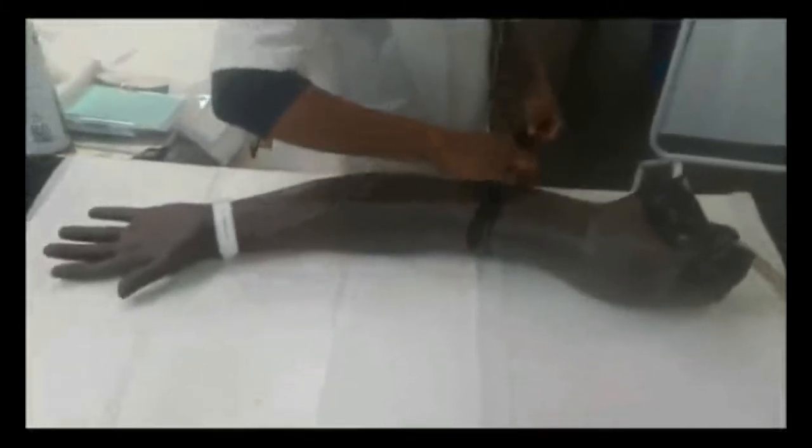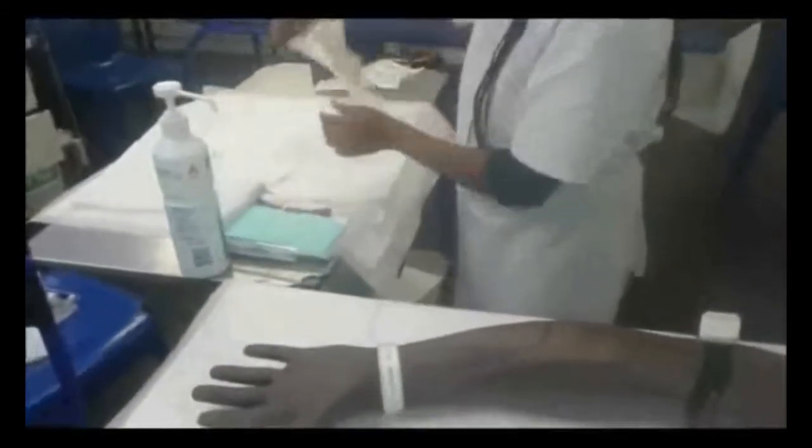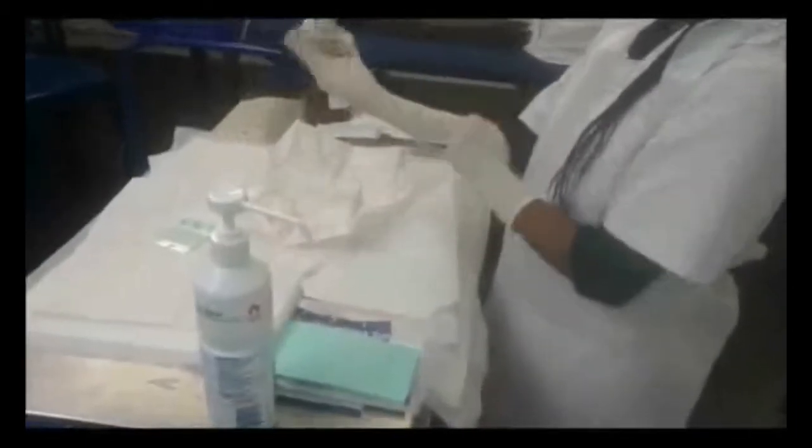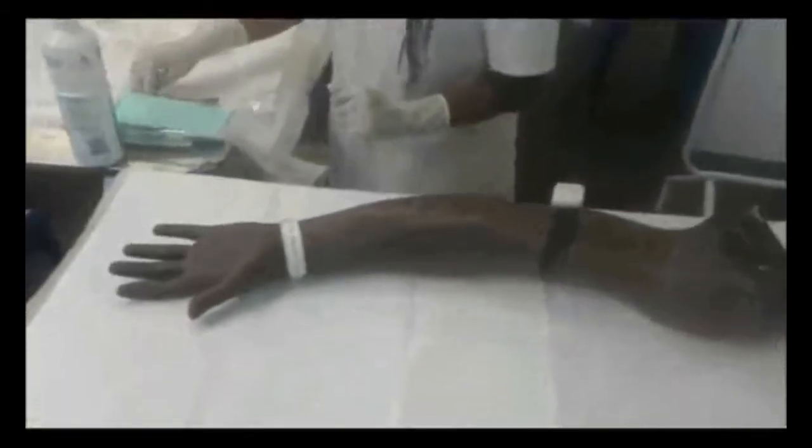Next step will be to put on your tourniquet above the antecubital fossa. This tourniquet will help you visualize a nice vein in the fossa as a point of insertion. Next, clean your hands and get ready to put on your sterile gloves. Open your gloves onto your sterile field, making sure not to contaminate them. When you're done putting on your gloves, this is when you pick up your cleaning swab or your cleaning gauze.